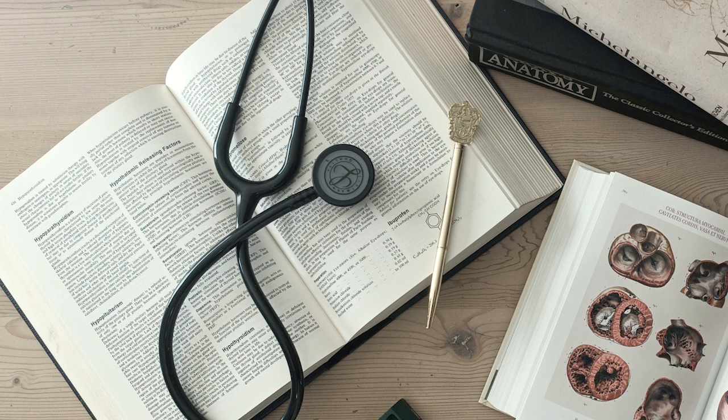Okay. And ventricular flutter? In ventricular flutter, you'll see regular, very fast, large waves that essentially are the QRS complexes, but they look very abnormal, wide, and sinusoidal. It looks like a continuous undulating wave, making it hard to distinguish individual P, QRS, or T waves. It's just this rapid, regular, wide, complex rhythm. Okay, big regular waves. Now, fibrillation.